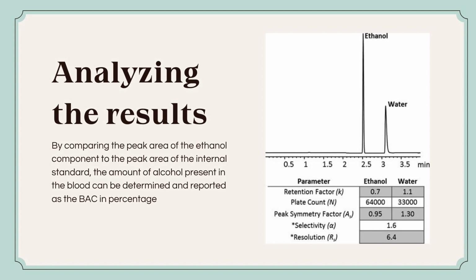Analyzing the results. By comparing the peak area of the ethanol component to the peak area of the internal standard, the amount of alcohol present in the blood can be determined and reported as the BAC in percentage.